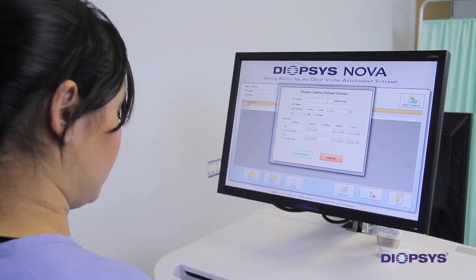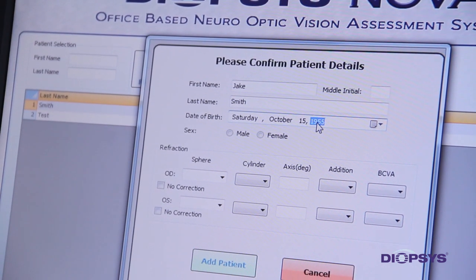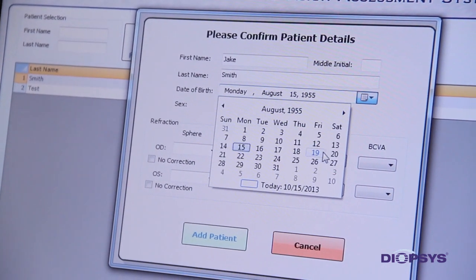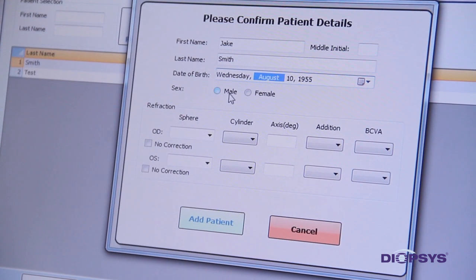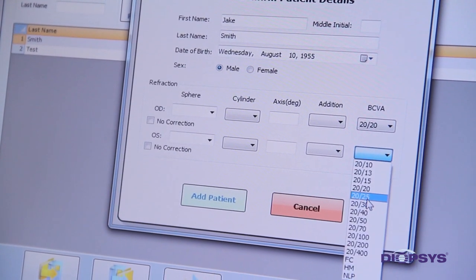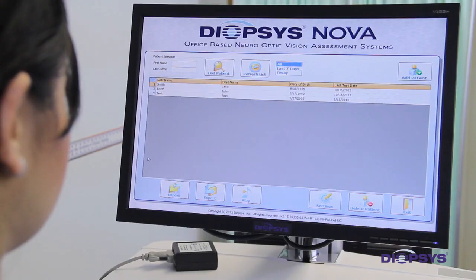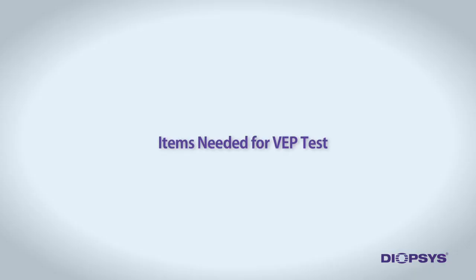Begin by entering all patient information into the Diopsis NOVA software for those patients who will be tested for the day. Later, as patients are brought to you for testing, you will be able to click on the patient's name and proceed directly to patient preparation and with running this test. This will help with patient flow.